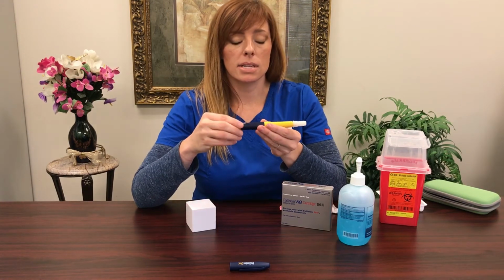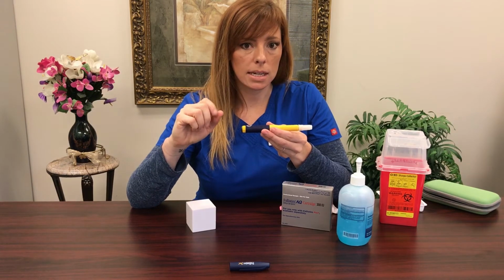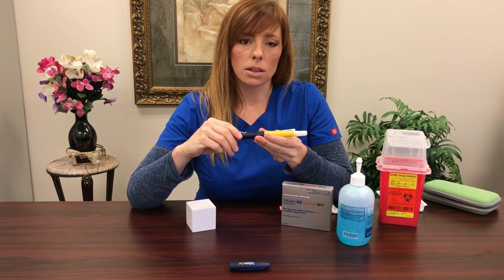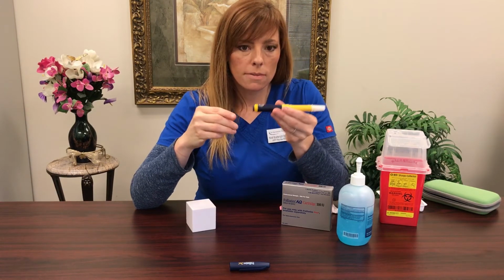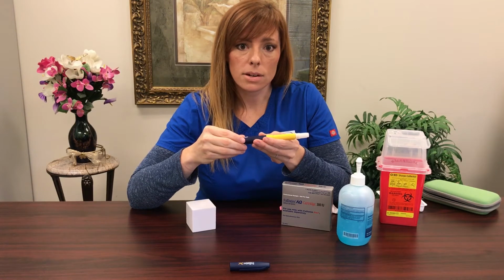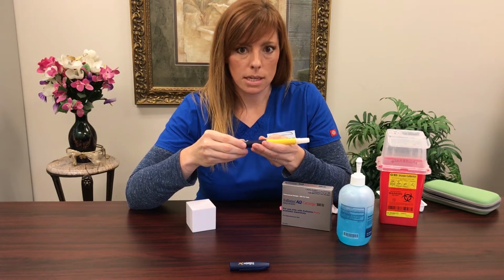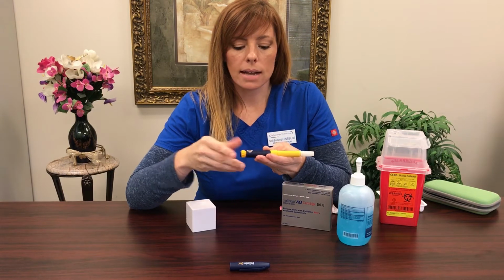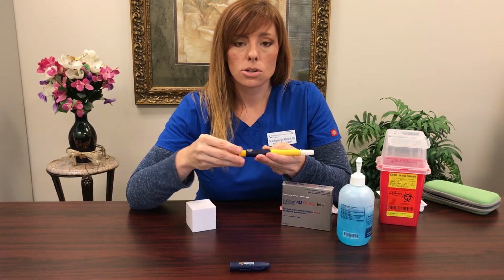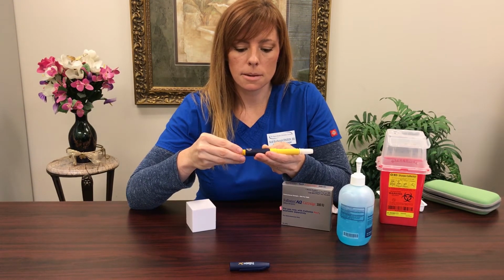To dial our dosing, you're going to notice that on your calendar, you'll have the opportunity to write in your dosing. Your doctor has chosen a dose specific to you and your cycle, along with your health history. For the Follistim pen, a typical dose may be as little as 75 units a day or as much as 450, and anywhere in between is absolutely okay as well. When you're dialing, you're just clicking the pen till you see your dosing. We're going to go to 225 today because that seems to be a popular dose for some patients.